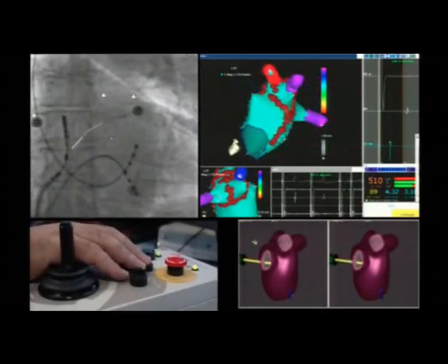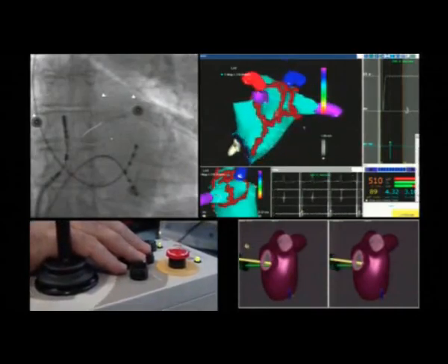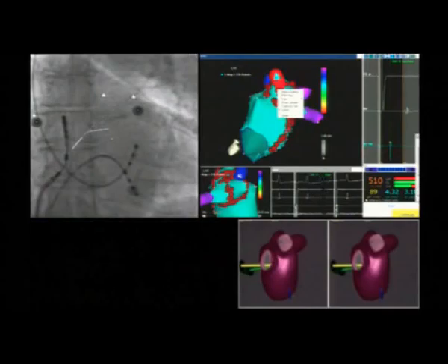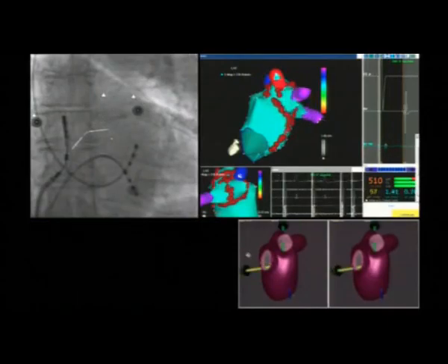When the lesion set is complete, the operator checks all the ablated areas for the completeness of the lesions and can eventually add further radiofrequency applications to terminate the procedure.